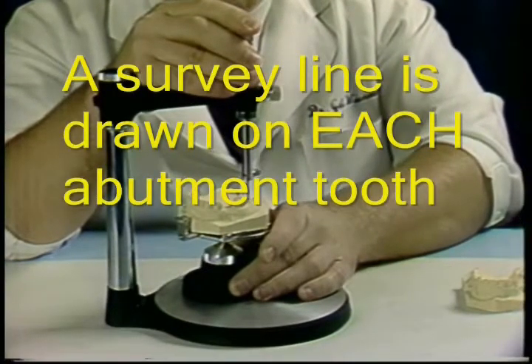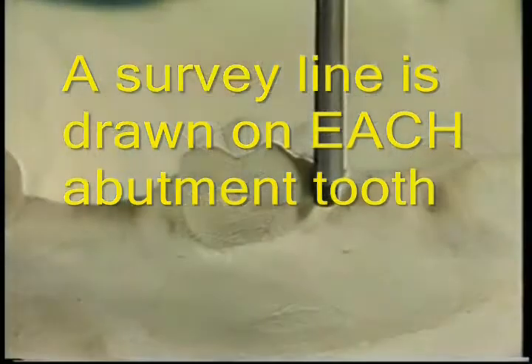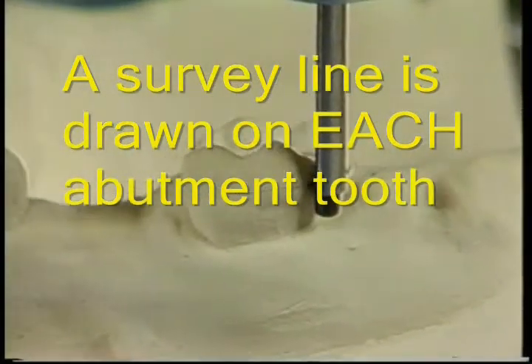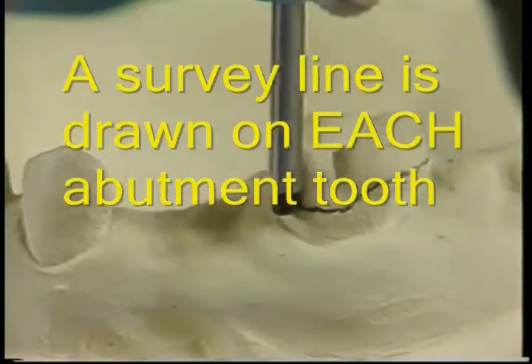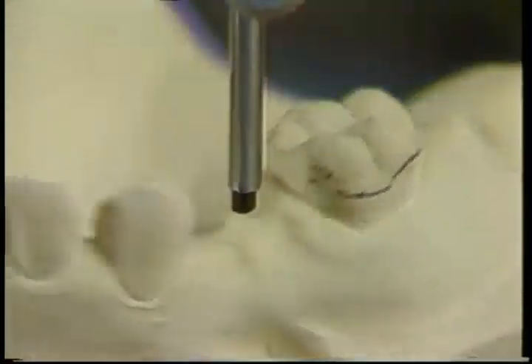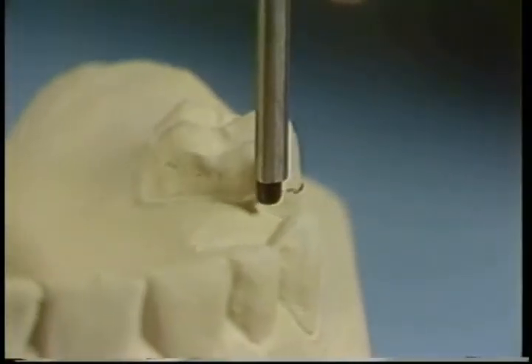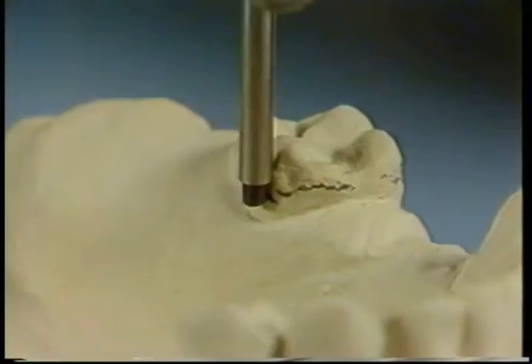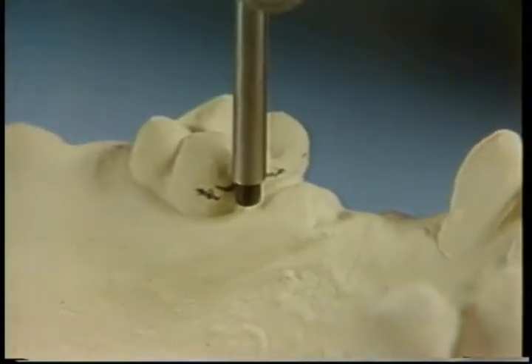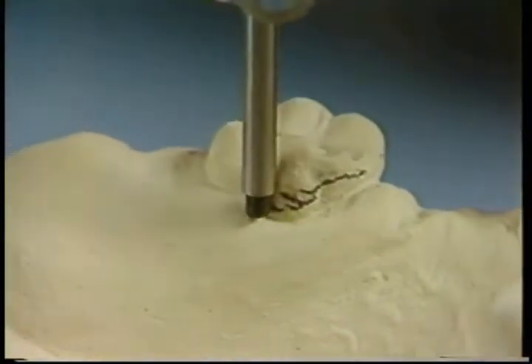The survey line is drawn on each abutment tooth. Notice in the example, the survey line is being marked for the entire circumference of the abutment tooth.